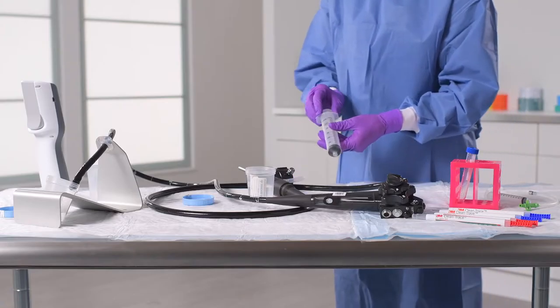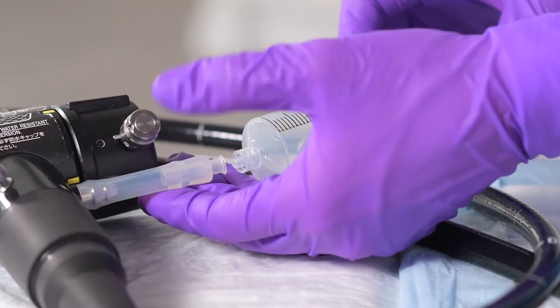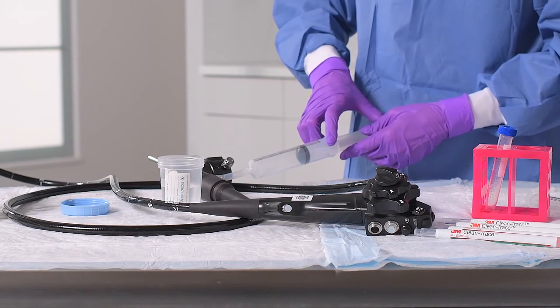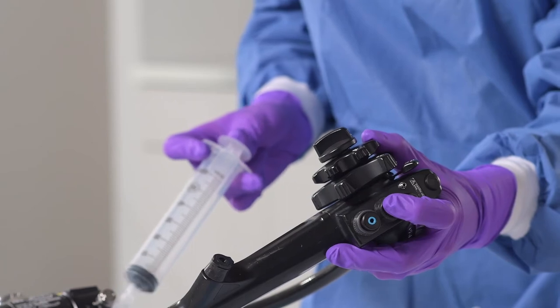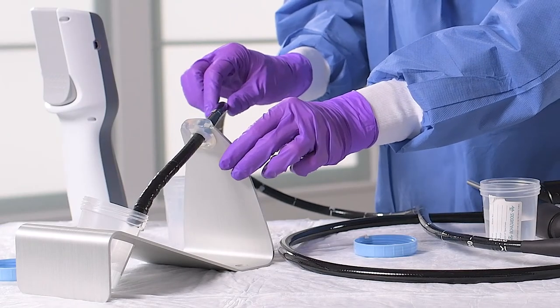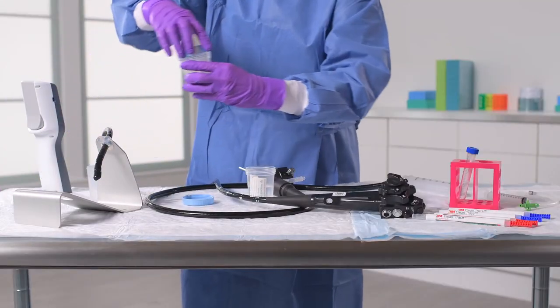Next, detach the syringe from the connector and draw in 60 cc's of air, then reattach to the connector. If using the plug, press down on the syringe to push air through the endoscope. Otherwise, press down on the suction valve while pressing down on the syringe. This air flush will push any rinsate remaining inside the endoscope into the collection container. We have another sample to collect, so for now, securely cap the sample collection container to maintain sample integrity until we are ready to test it.